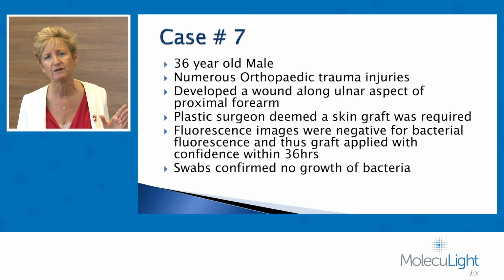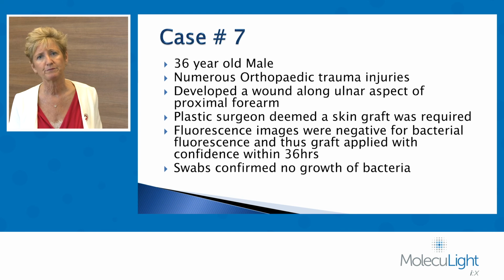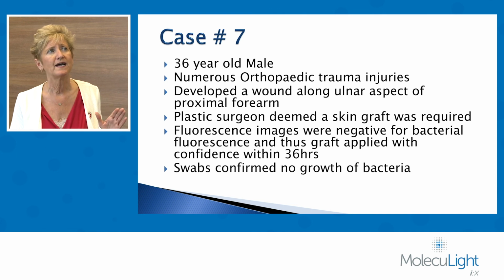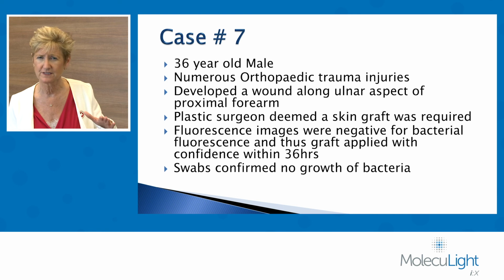One last case study I'll share with you was around the skin graft application. We had a gentleman, 36, who had a real nasty trauma in the States, and then he was from Canada, and he came back up to us for his follow-up care. When he arrived with us, we quickly looked over all of his wounds, and in particular, he had some full thickness injuries on his arm. And so we knew he needed to be skin grafted, and these things take a while.